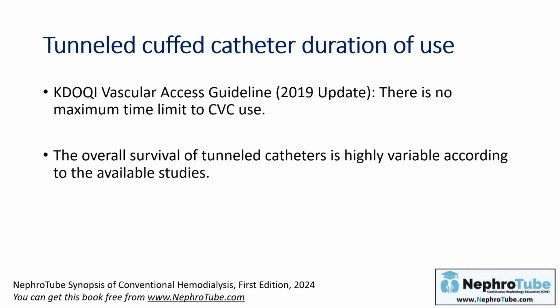For example, some reports showed that the survival of these catheters and their patency ranged from 77 to 80%, 87% at 6 months, and from 72 to 76% at 12 months. In one report, some patients had functioning catheters for 343 days. In another report, they were functioning and patent for beyond 2 years, and so on.